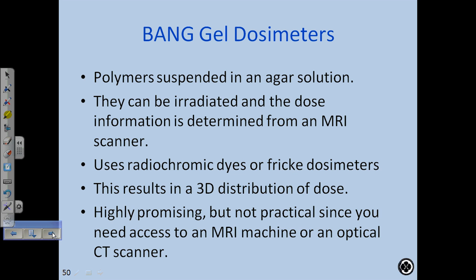Okay, so now the MRI is the reader. We're not using an electrometer. We're not using a TLD reader. We're not using a photomultiplier. We're using an MRI to measure dose. So the MRI signal is proportional to dose. Higher signal means more dose.